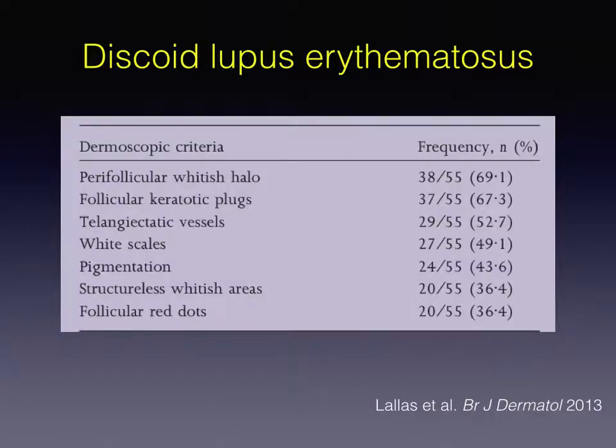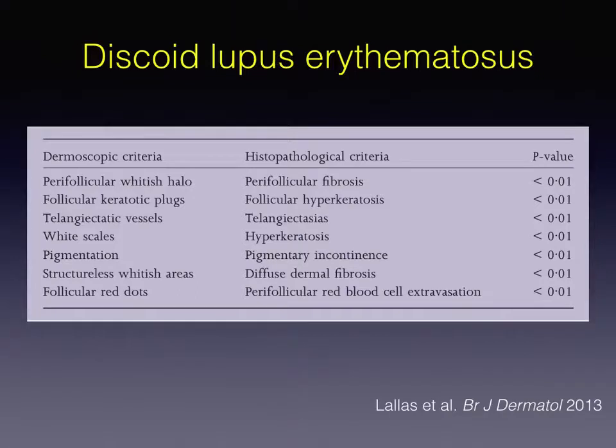This is a plaque developing on the cheek of a 60-year-old man. This is an early lesion of discoid lupus erythematosus, displaying under dermoscopy a few follicular plugs and the characteristic perifollicular whitish halo that correspond to early perifollicular fibrosis. Several dermoscopic features have been found in discoid lupus erythematosus, and they perfectly correspond to the various histopathologic alterations that take place during the course of the disease.